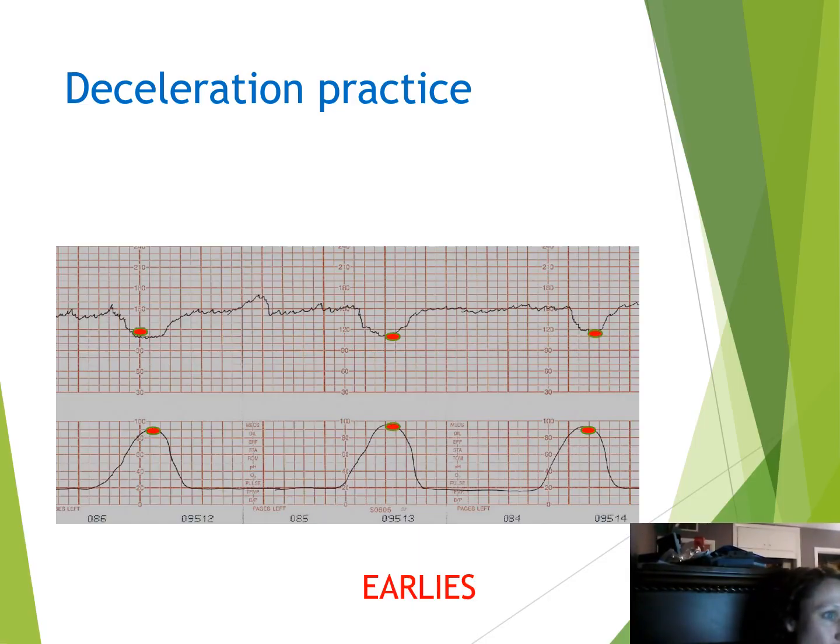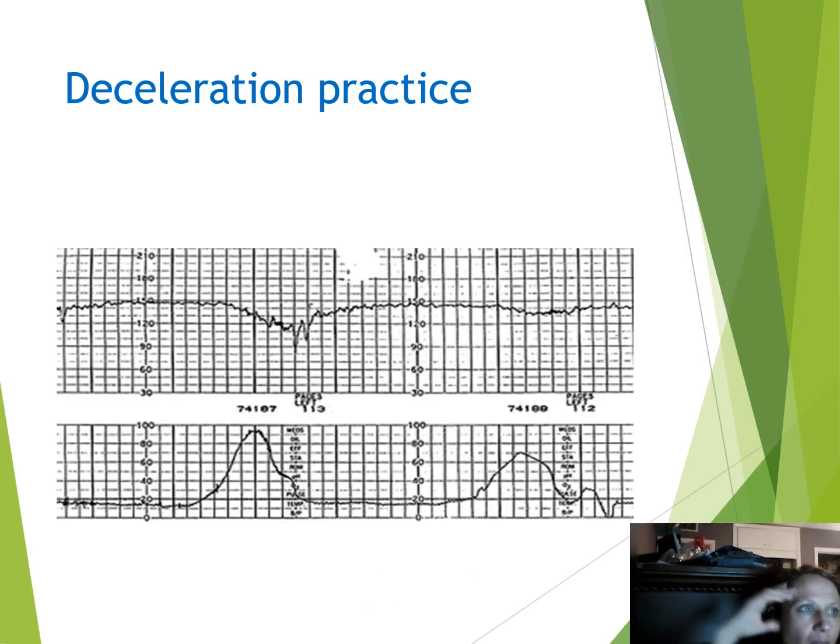So this just shows you with our last slide how the nadir of the decel matches up with the peak of the contraction. So it's really cool. Okay. And I think this might be the last one.